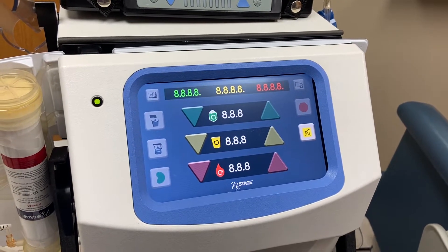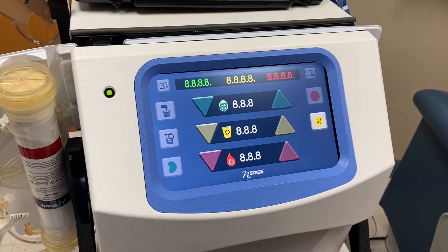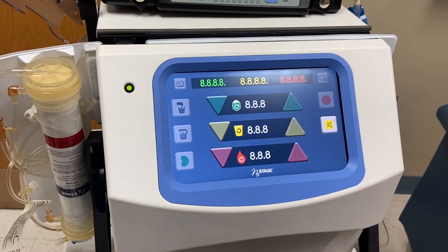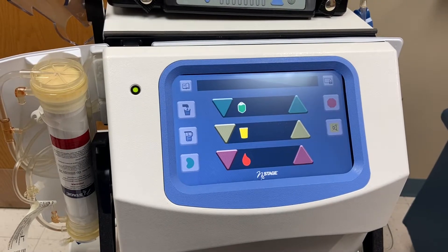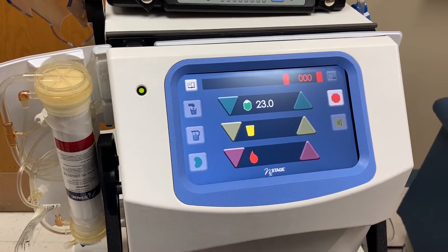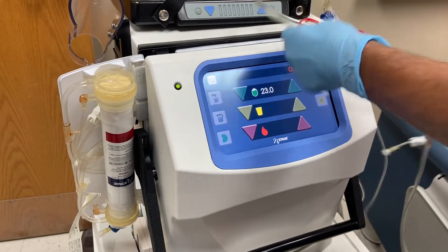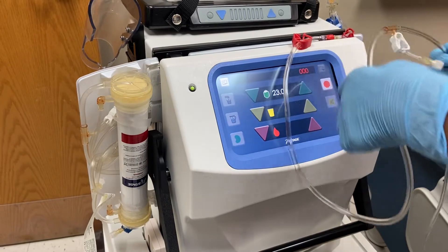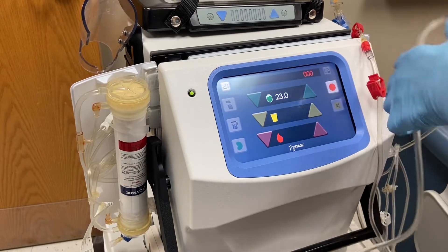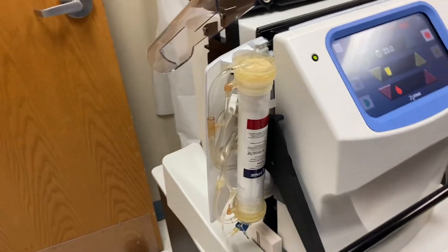This video shows how to set up your cycler. After the alarm test, the machine is alarming with 888. Press mute, and it will display A, B, C, D — then mute again. Now you can start tapping and snapping to remove air from the red line. Follow the flow of the saline as it flows from the red and from the bag, then go to the dialyzer.